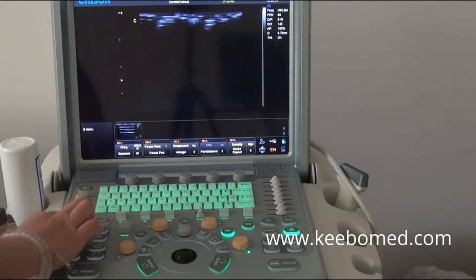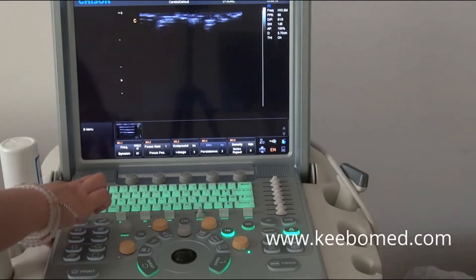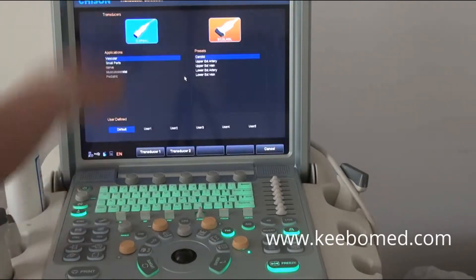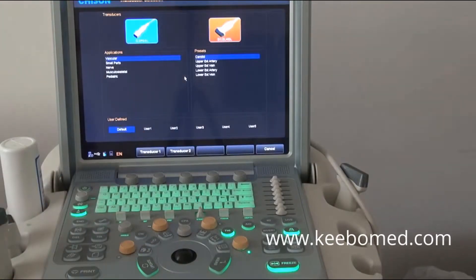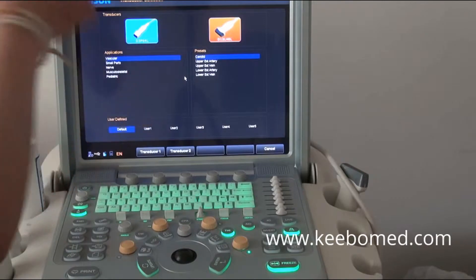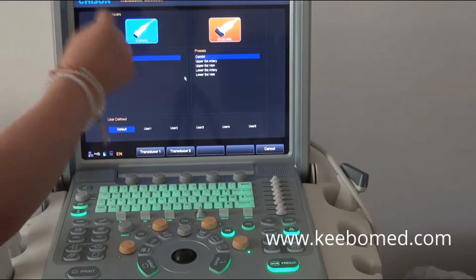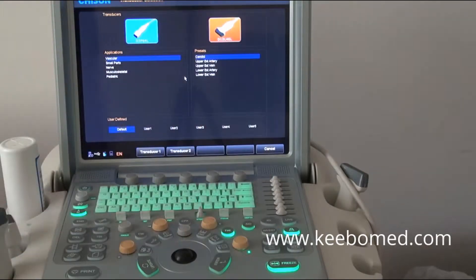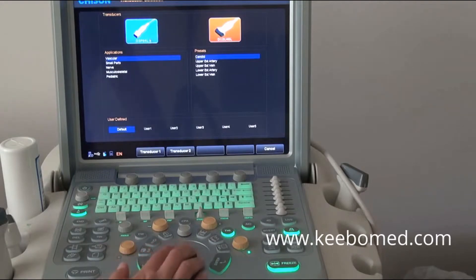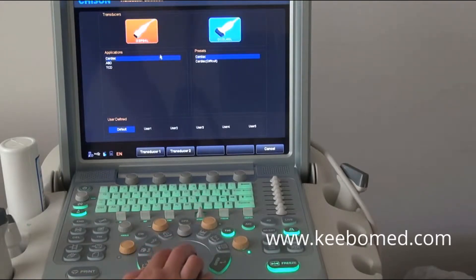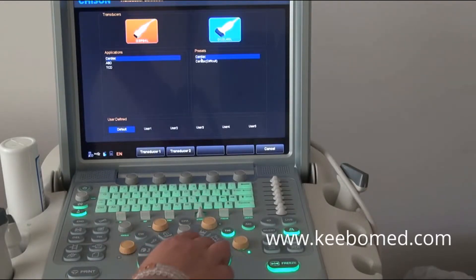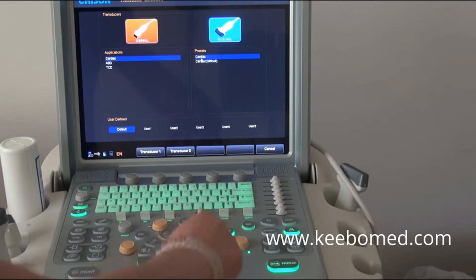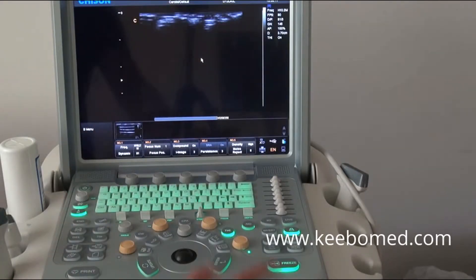Let's get started. Press the probe key to go back to the probe selection screen. You will find the Q9 can support two probes at the same time. First of all, we choose the phased array group cardiac application, and click the application twice again to go into B mode.